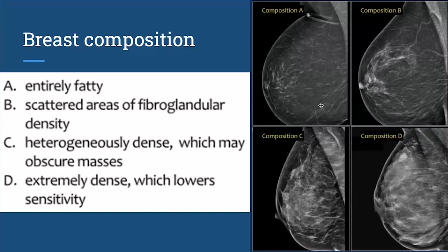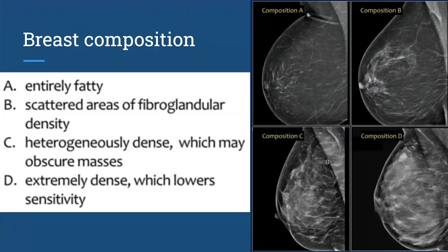All breasts are composed of fatty breast tissue, which is the darker gray color, and dense fibroglandular tissue, which shows up white on the mammogram. The more dense fibroglandular tissue you have, the more you are considered dense. The last two categories — heterogeneously dense and extremely dense — are the categories considered dense. This is fatty breasts, and this is a scattered breast.